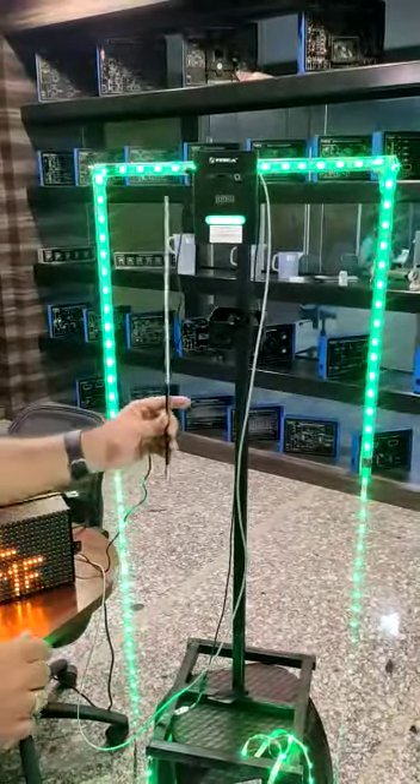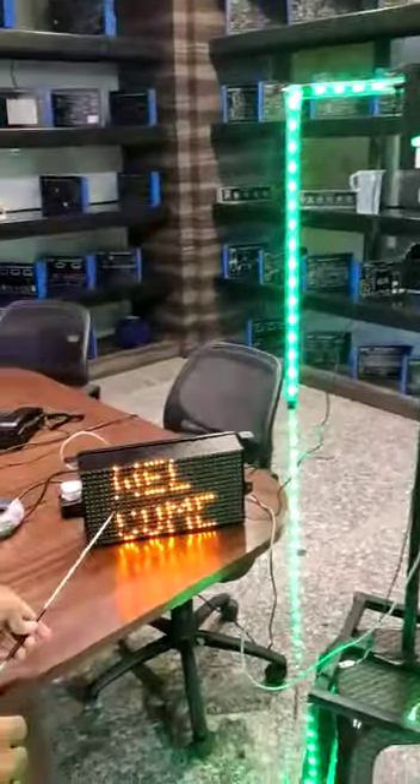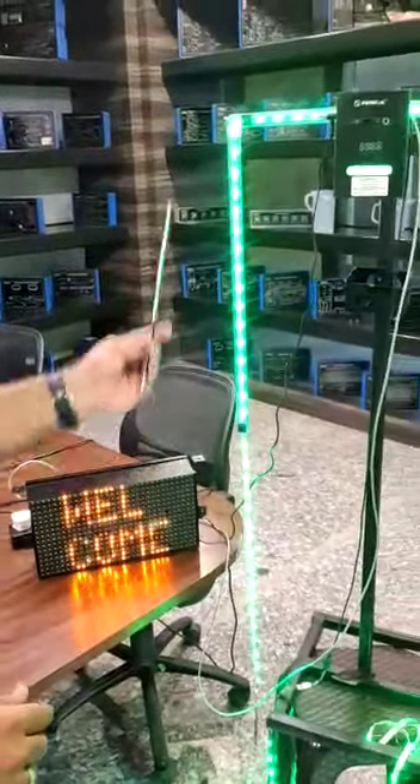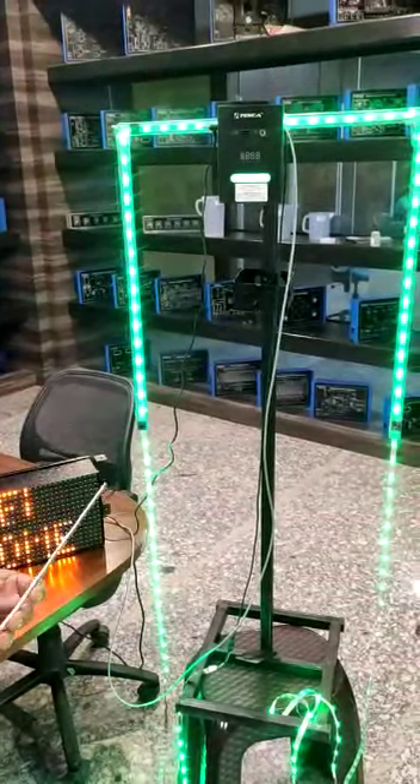In this unit we have the temperature sensing unit here. This is the temperature display board and this is the LED indicator which gives the entry signal.